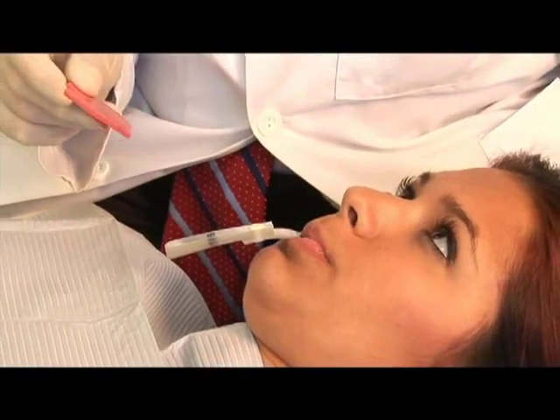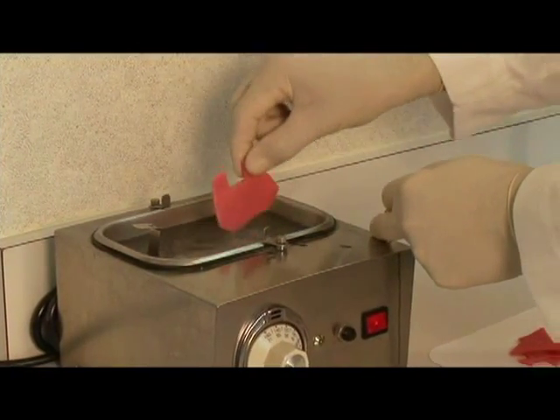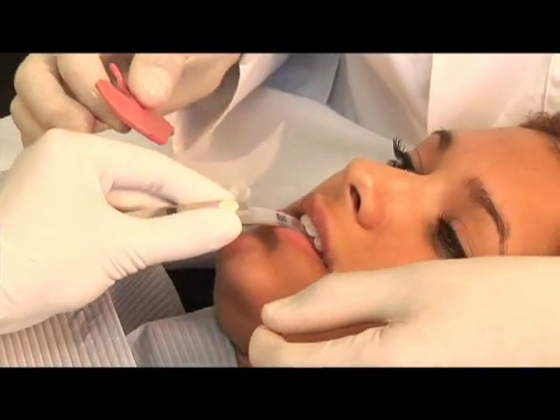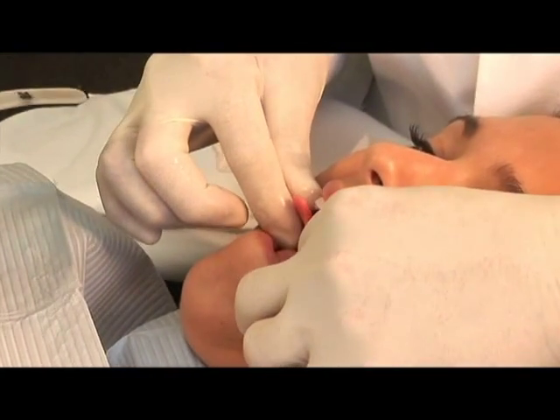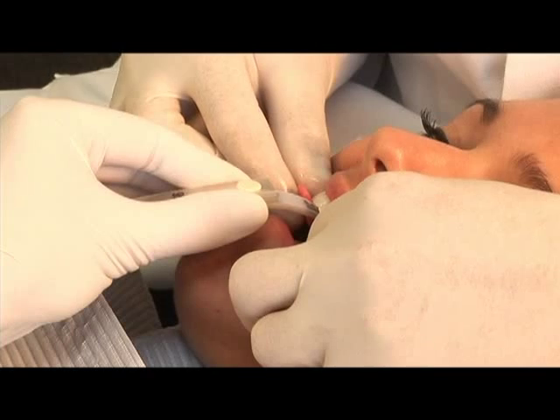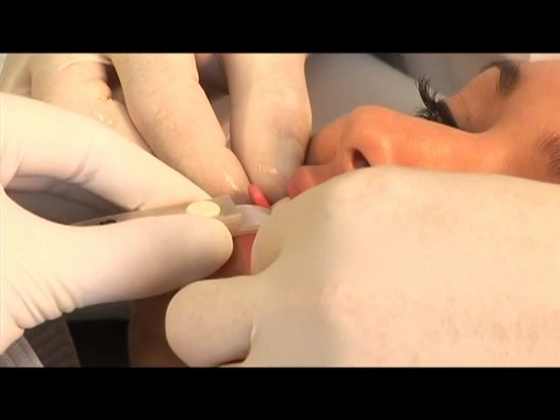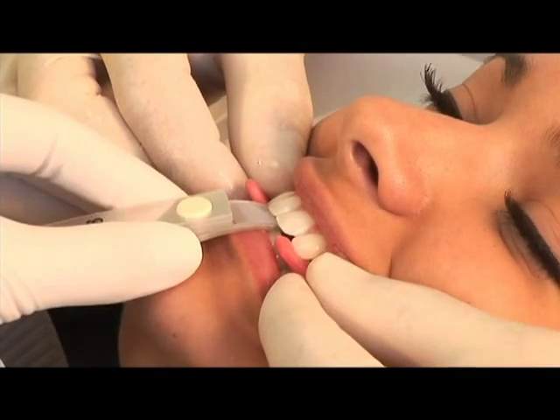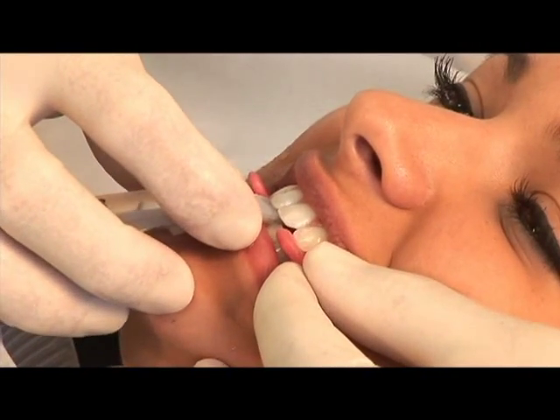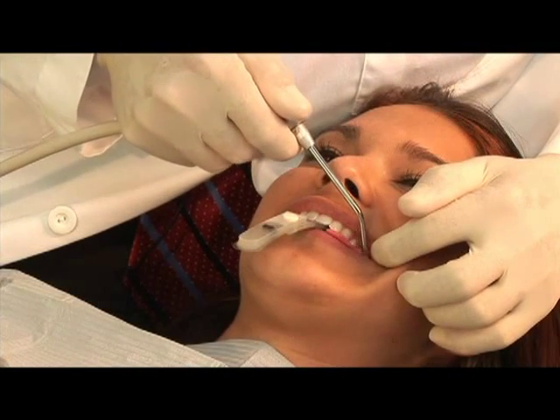What we're going to do next, I'm going to soften this wax. It's a very specific type of wax, and I'm going to get it nice and soft in a hot water bath. Remove the leaf gauge and place the softened wax into the mouth. Next, place the leaf gauge between the teeth and through the pre-cut slot. Instruct the patient to close on the registration wax and then protrude and retrude, then squeeze lightly together. To ensure the material is set, chill the wax with air.